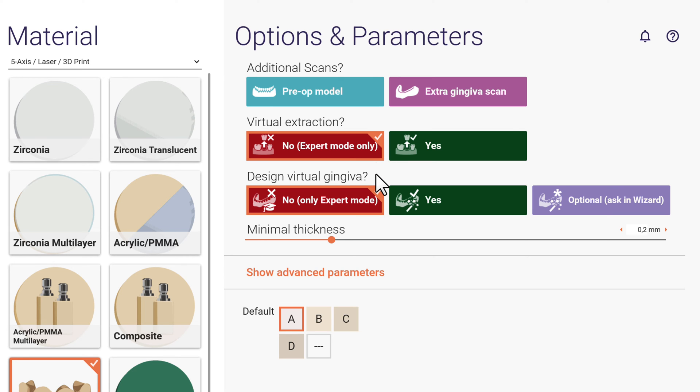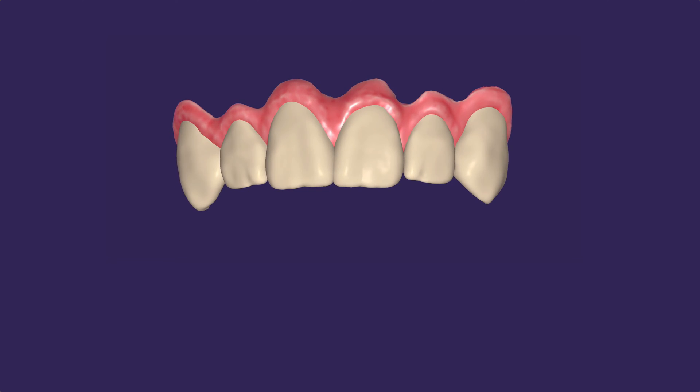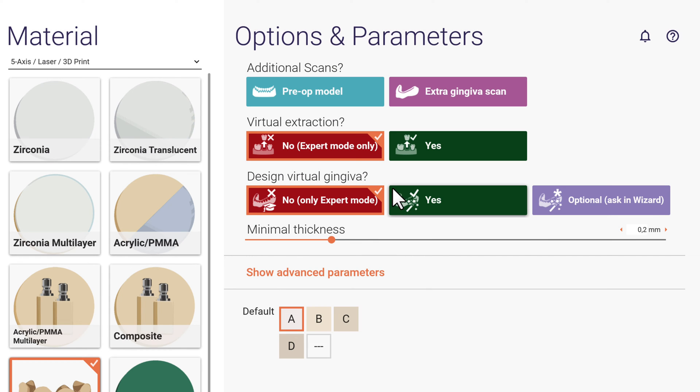Virtual gingiva — especially if several teeth have been extracted, a virtual gingiva may be necessary to replace the lost tissue as well. If you know already that you want to do it, you can pre-select yes, so it will be part of the step-by-step routine. Both options will be explained in detail in separate video tutorials.